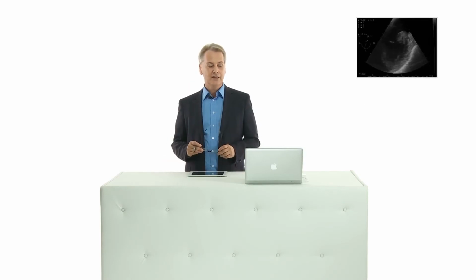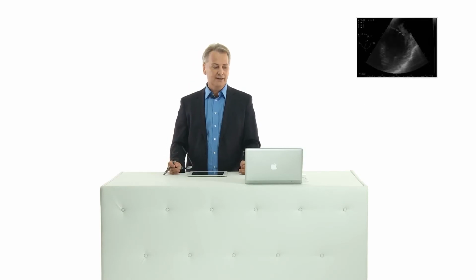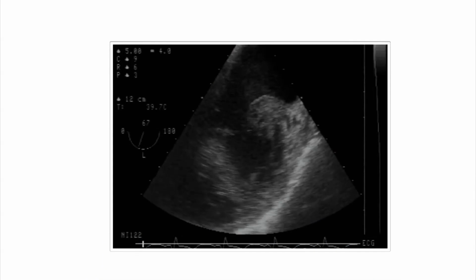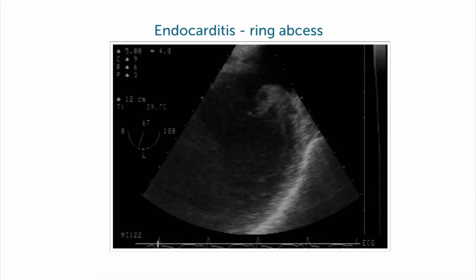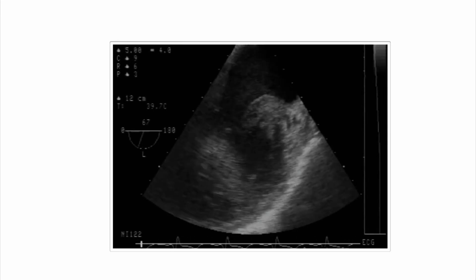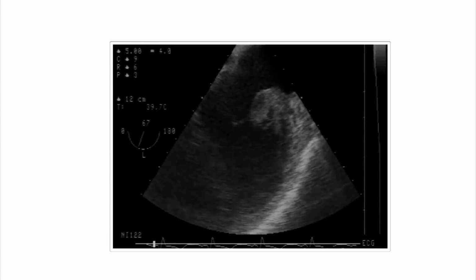It was actually a young colleague of ours who practiced in a rural area of Austria, and he developed tonsillitis. He treated himself rather late with antibiotics. Then he was brought to an intensive care unit, and there they performed all sorts of tests but did not perform an echo. He was then transferred to our department, and even there it took a few days until a TE was performed, and then we detected this massive endocarditis. The patient had staphylococcal endocarditis of the mitral valve with abscess formation, and unfortunately, even though we rushed the patient to surgery, he died.